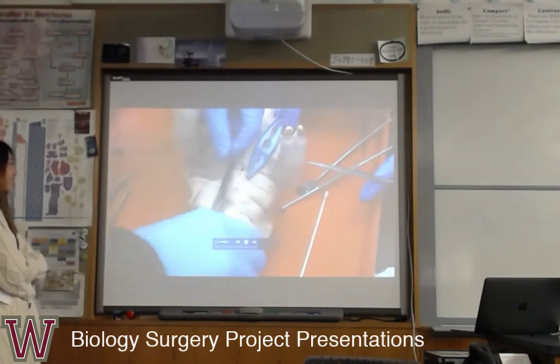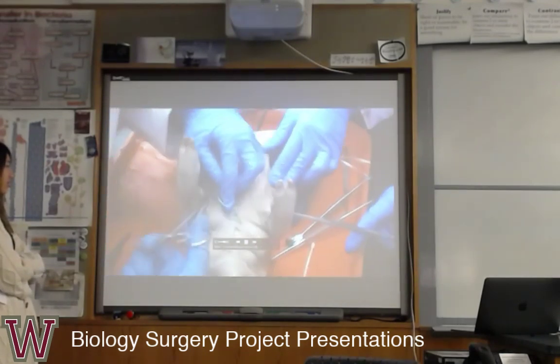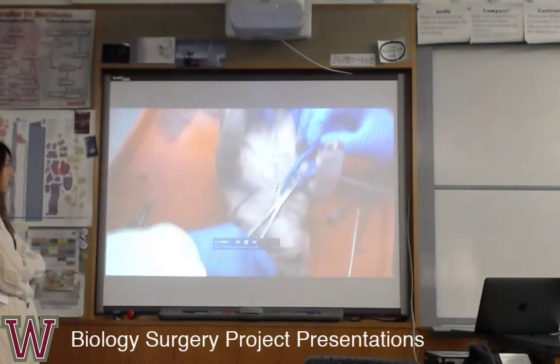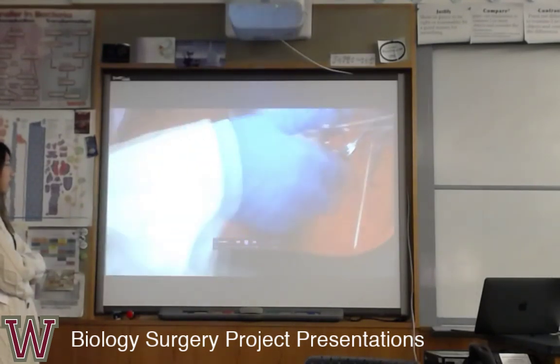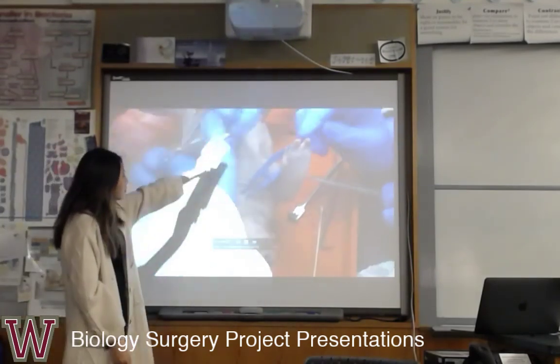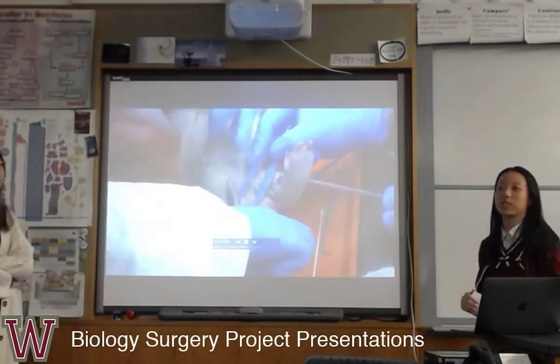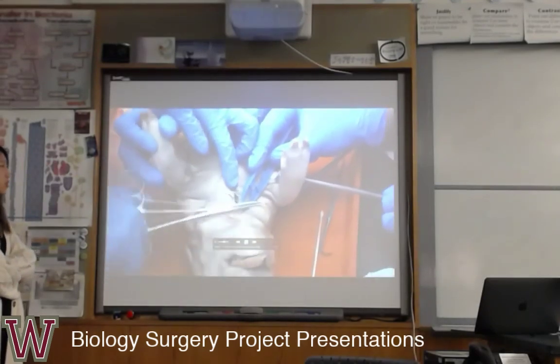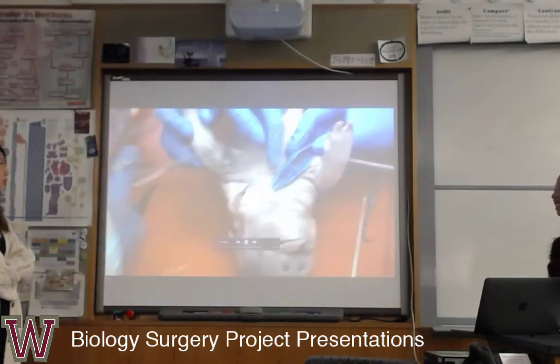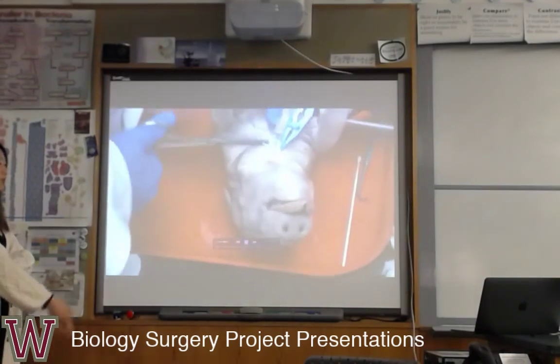During the surgery, we actually made two cuts. This is the first cut, which is really long, and then we also have a second cut beside the first big one, on the side. So we were not able to sew it in one go. At the first time we cut the pig, we couldn't find the heart and we cut not very well, and the second time we cut it thoroughly, directly.